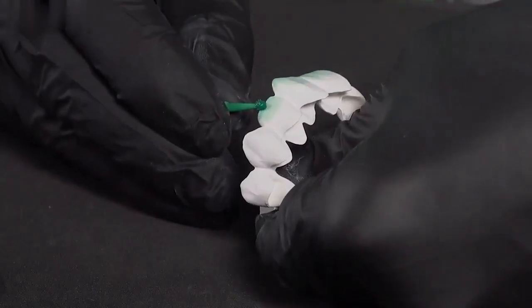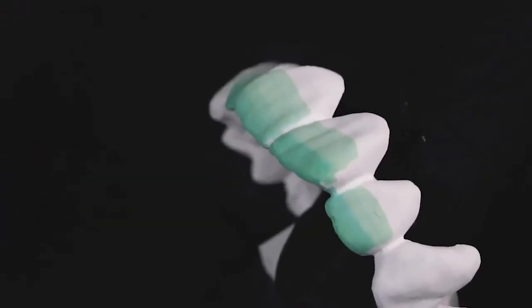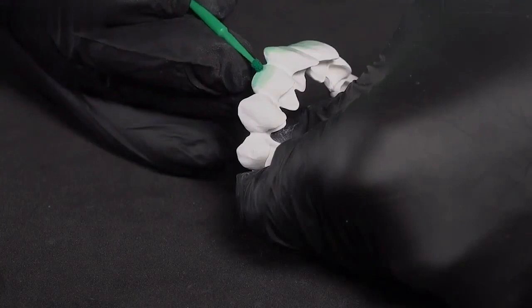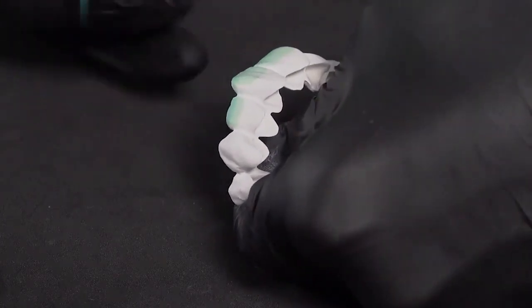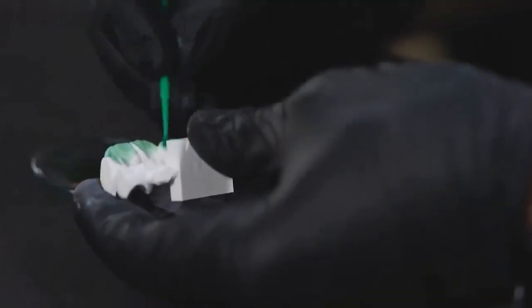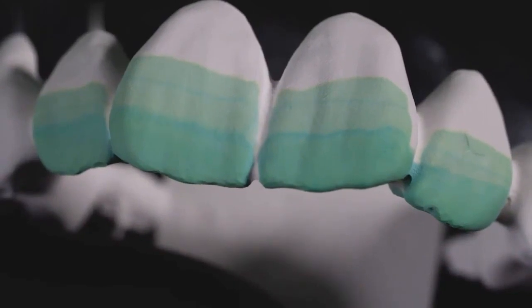So, then I turn back to myself. Then we now have the first 3 layers, and the last layer just comes right over the third. It's also the case in natural teeth that you have the greatest translucency at the top and you get a nice, smooth gradient. I agree. And now exactly the same again, application width here on it. So, and now we turn around our bridge and then we do that again palatally on the inside and here really very carefully on the incisal. Yes. And then we're just done.